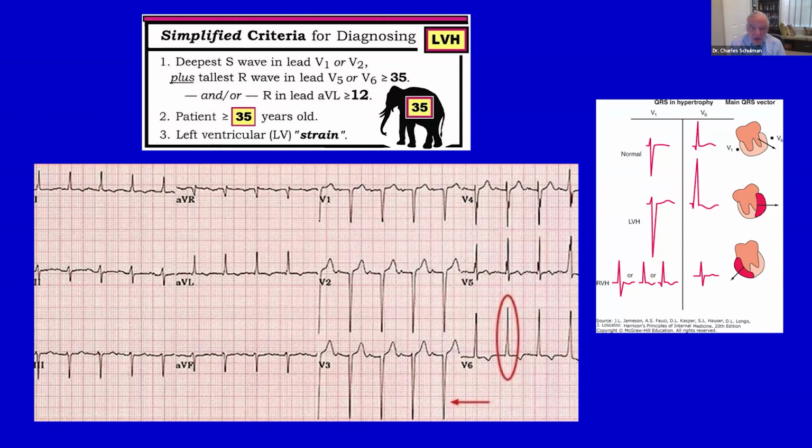Okay, for patients with newly diagnosed hypertension without a baseline EKG, can the EKG be done in the PCP office, or should it get done and read by a cardiologist? No, I think you can read it. You can do it. And the chances are the machine reading will be correct. Although I have a whole collection of ones that are not correct. But then again, I'm looking for those.